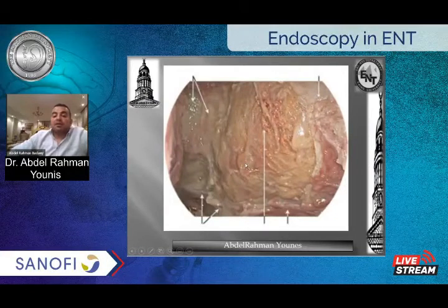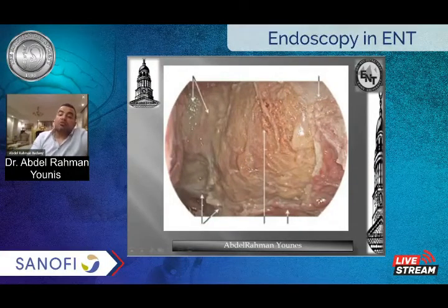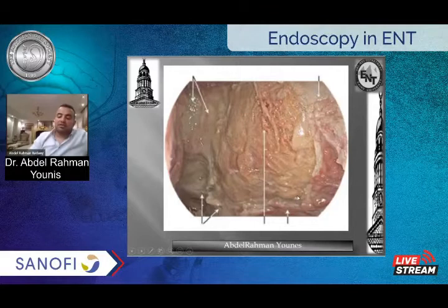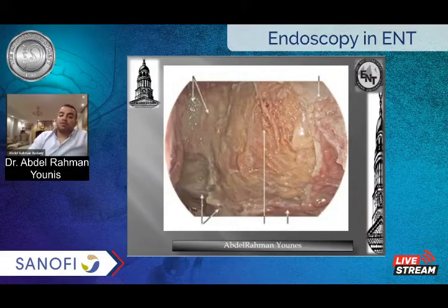We can extend the decompression by removing the floor of the orbit through the maxillary sinus, but try to leave a thick bone ridge between the medial orbital floor and medial orbital wall, to avoid prolapse of the whole globe inside the sinus cavity and consequent enophthalmos.